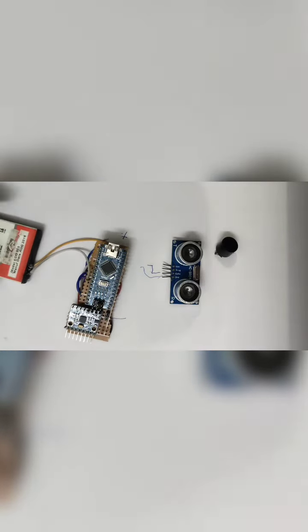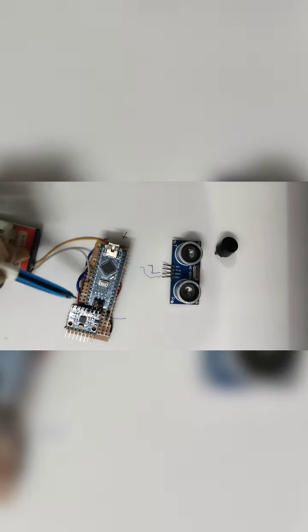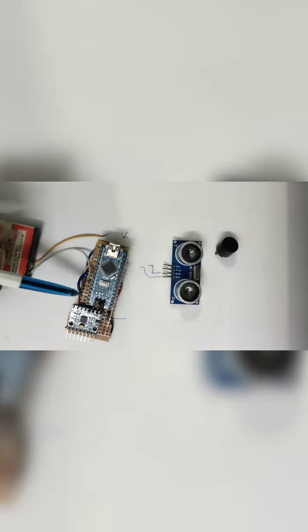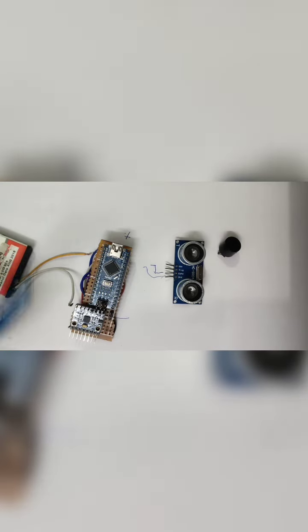After coding, connect the battery positive terminal to the VIN of the Arduino Nano, which is also called plus, and connect the GND pin to the GND pin which is in front of the VIN pin. And you can also join a switch to close and open the circuit.